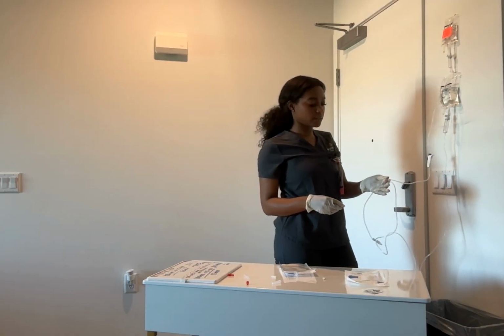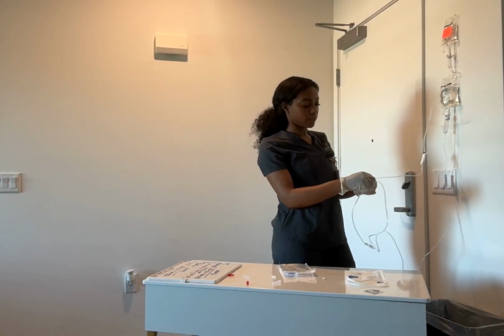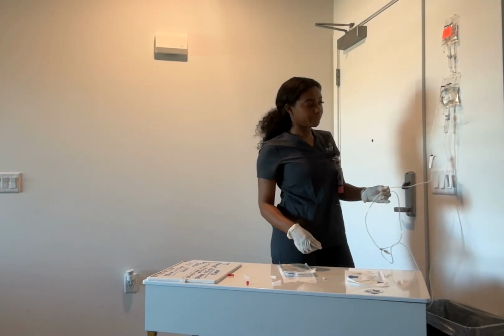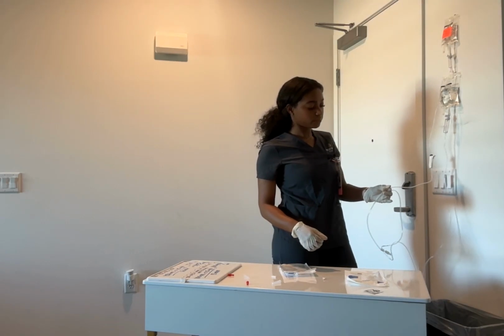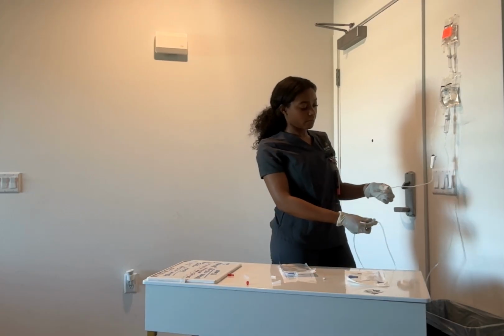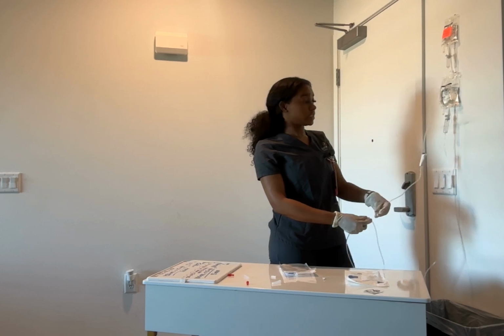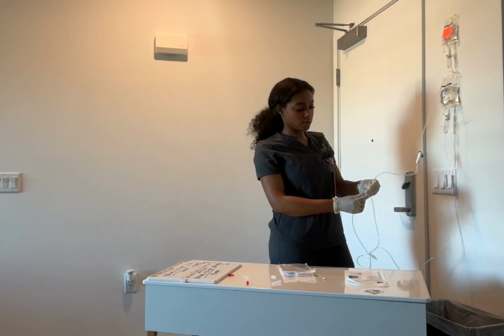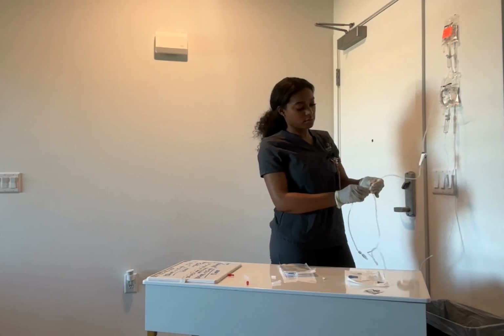About 20 seconds, letting it dry. And the other side, 20 seconds. And then we're going to attach the primary and secondary together.